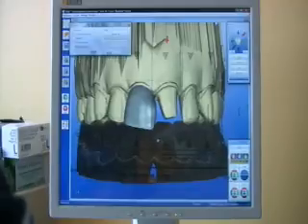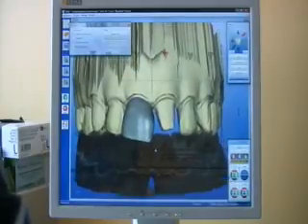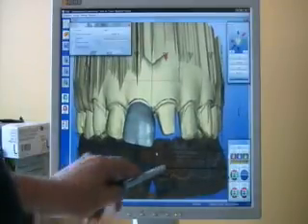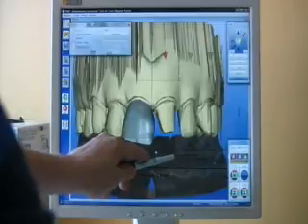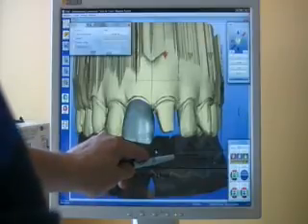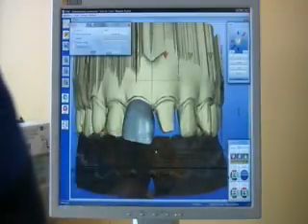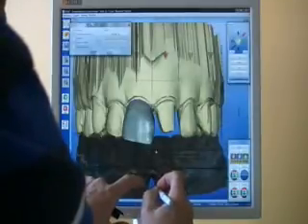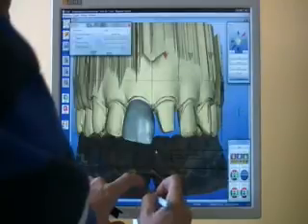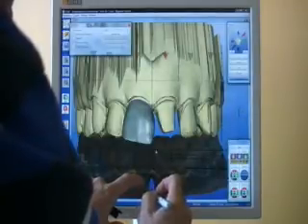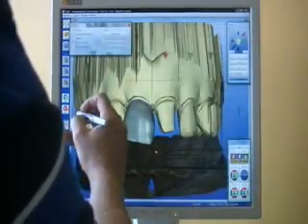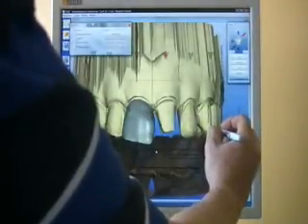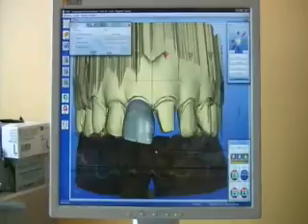We want the buccal aspects of the cuspids to line up with the outermost lines on the overlay. We will click so the antagonist is visible and line up our virtual models. We will then mark the overlay and mark the keyhole. This will allow us to quickly and reproducibly place the virtual model on the overlay. I usually define the buccal aspects of the premolars.